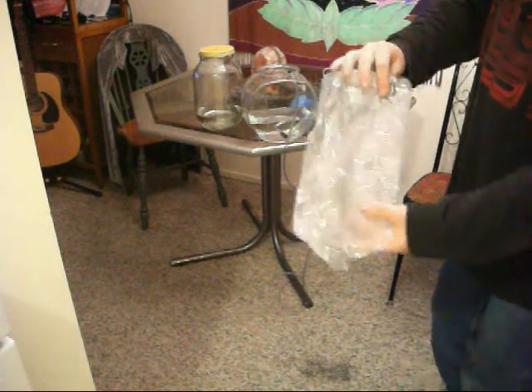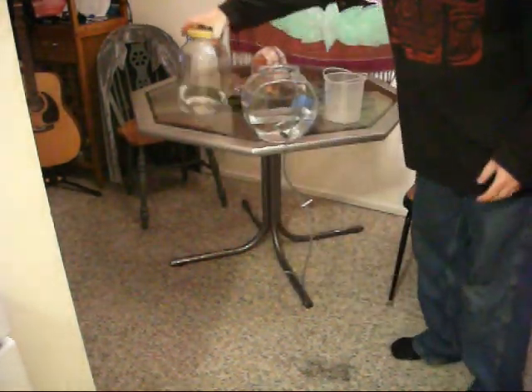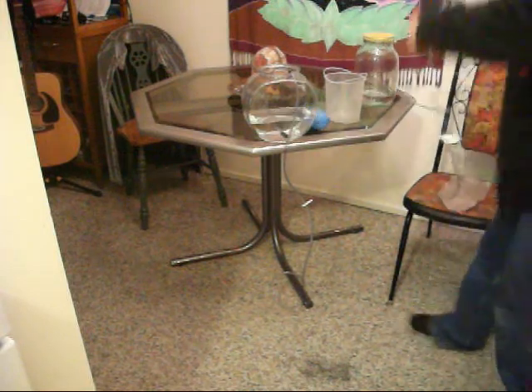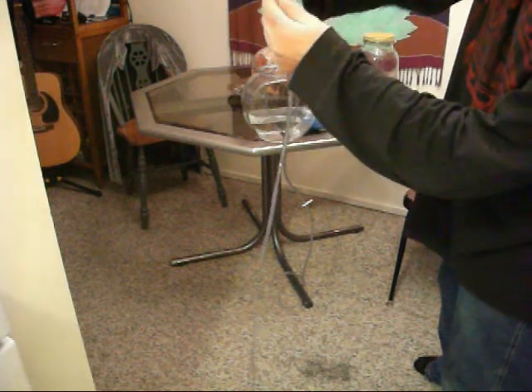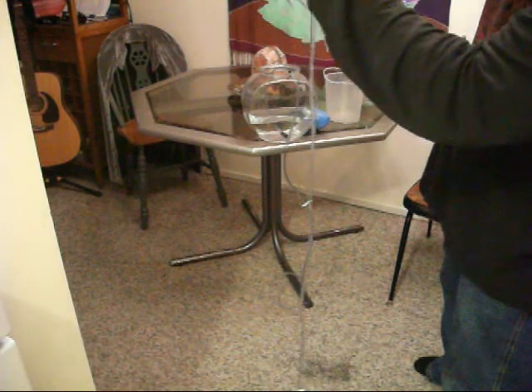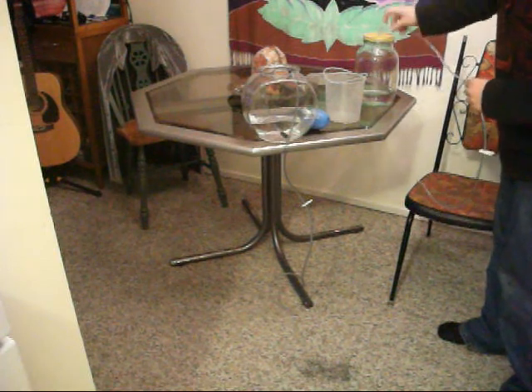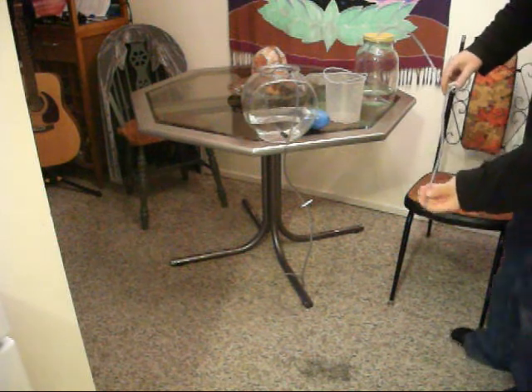It may sound complicated on this video, but you buy one of these bags, and then you get a jar, like a pickle jar like this. You drill a hole in it, and that's it. Because this part that is attached right here, it comes like this, and when you buy this disposable bag, this part is attached, and you hang that, and that's your enema. So you cut that off, and all you do is buy the enema bag, drill a hole, and that's it. You stick it in down to the bottom, and then you turn it on, and that's it.